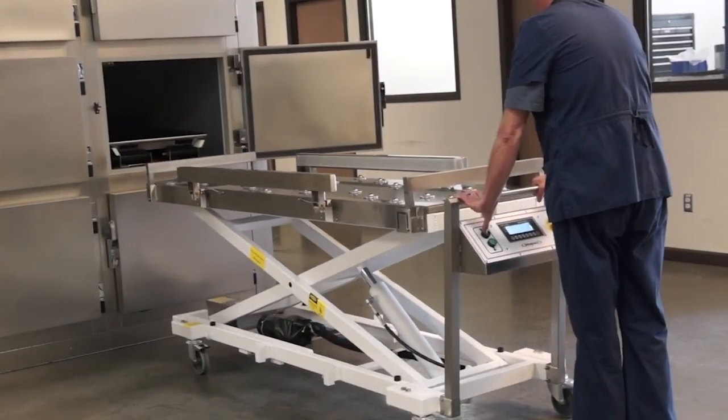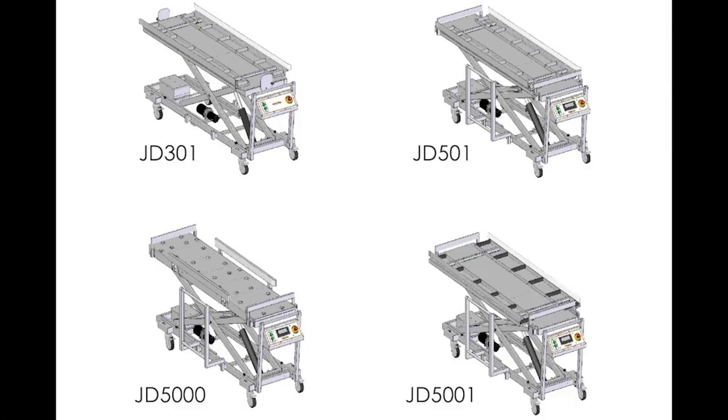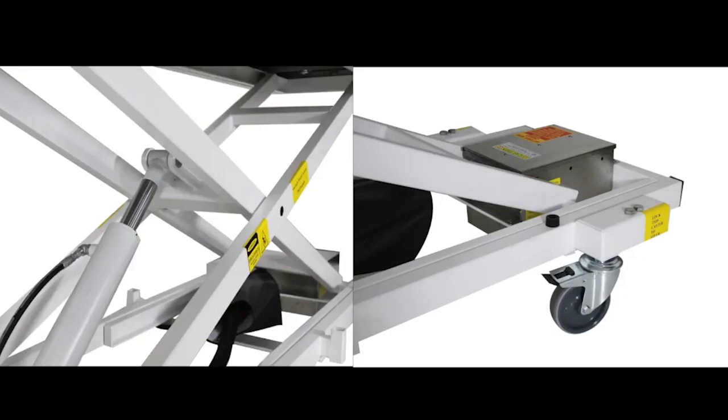A new standard in industry design, the Red Wing Cadaver Lift Series features four distinct models with unique adjustable tops and leading-edge features that will accommodate your lab's needs.